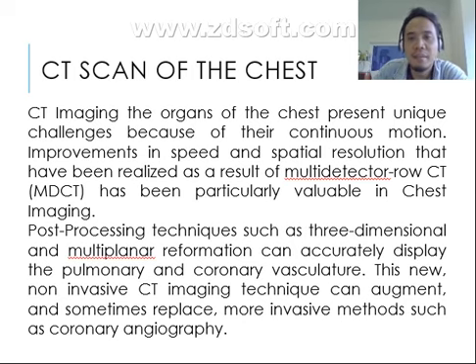Again, the primary challenge when we scan a CT scan of the chest is the continuous motion, because in our thorax we have the lungs with continuous movement from breathing, and the heart that continuously pumps, which are involuntary motions. So it is crucial on the part of the CT technologist to eliminate or reduce this so-called motion artifact.